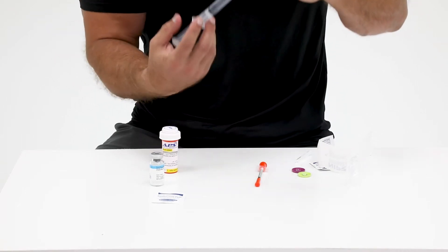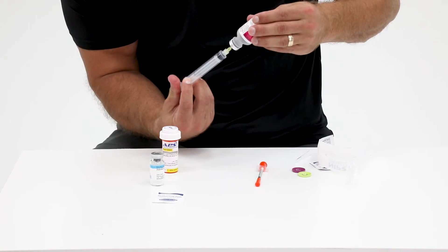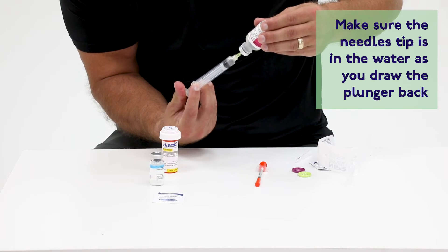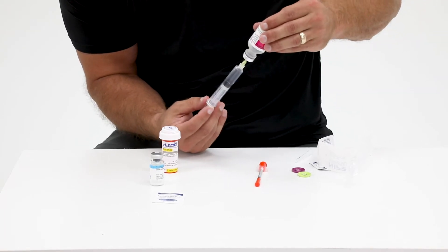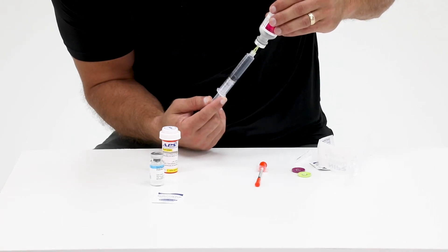Once the needle is inside, flip the vial upside down and push the plunger all the way to transfer the air from the syringe into the vial of bacteriostatic water. Then pull back the plunger to transfer the prescribed amount of bacteriostatic water into the syringe.